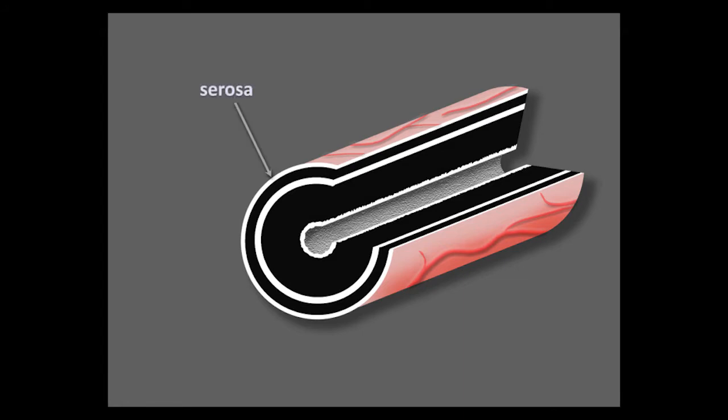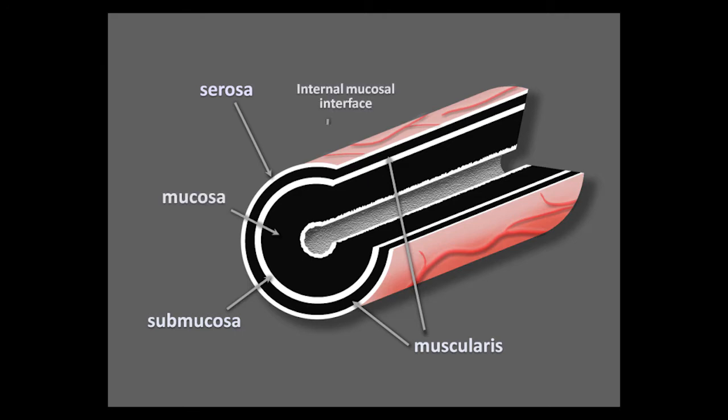First, the serosa, the external layer, appears as a thin hyperechoic line. Next, the muscularis is anechoic, the submucosa is hyperechoic, and the mucosa is anechoic. The internal surface of the mucosa is often covered by mucus and small air bubbles, and is hyperechoic. The lumen is usually either empty, or it may contain a small amount of gas or liquid of variable echogenicity.